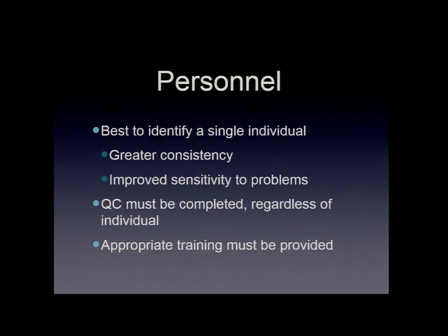Now, who's going to run the QC, the ongoing program? It's really best if you have the same person doing it, so you're minimizing some of the variation that may come, but that's not always possible, but at least to try to identify for that scanner. That way they're knowledgeable, they're familiar with how things work, they can identify the outliers a lot quicker than somebody who's new. They're just trying to figure out, how do I do this? And so then they get it and document it.